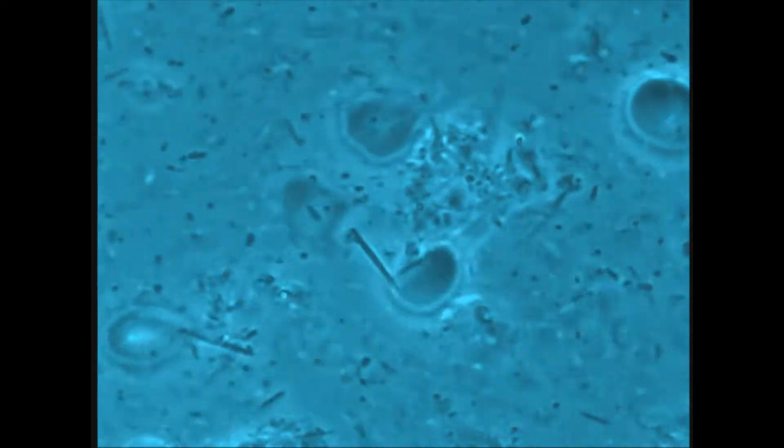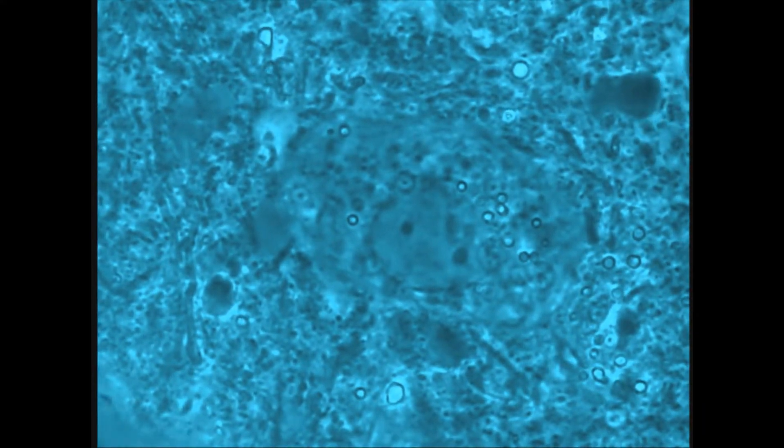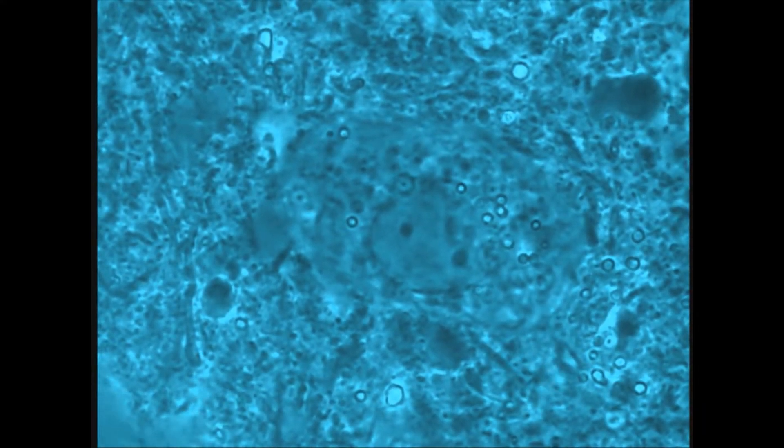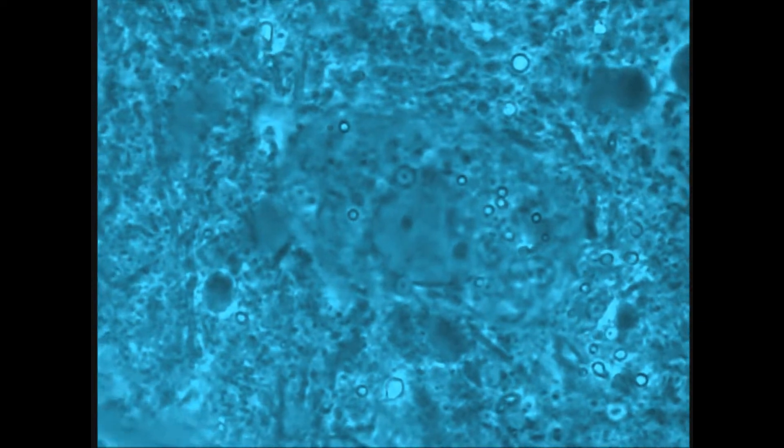Hi, Dr. Bonner. This is an interesting case, very beginning of periodontal disease. The patient is a 60 years old male and he has just one papilla, one 4 millimeter deep pocket. Everything was fine before and here we see the biofilm.